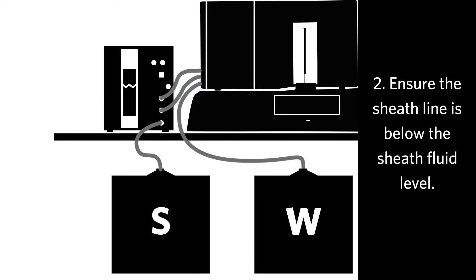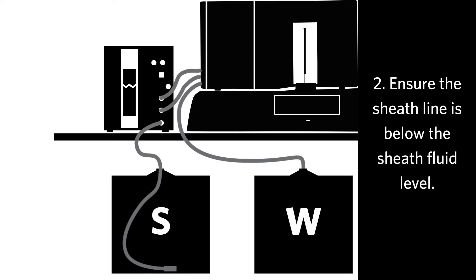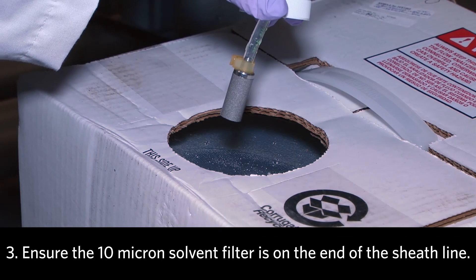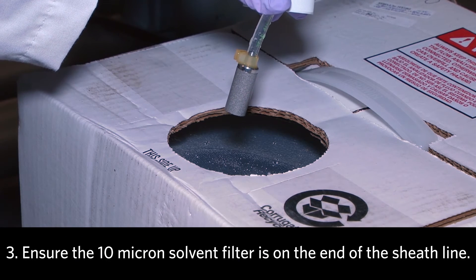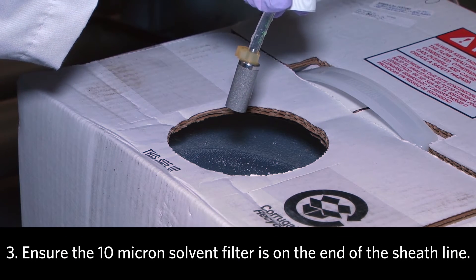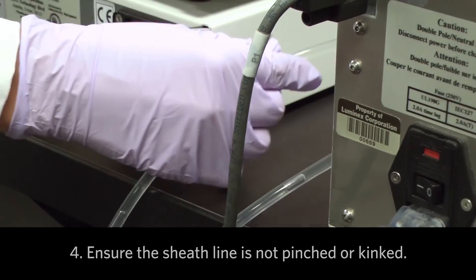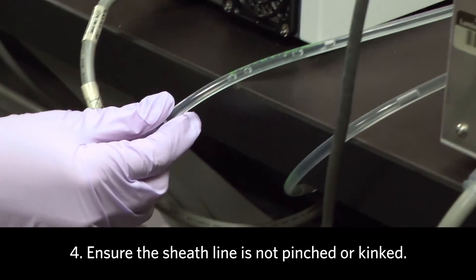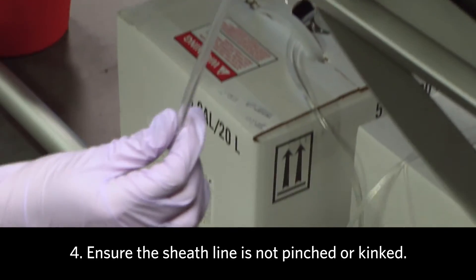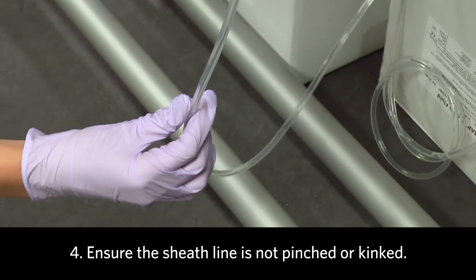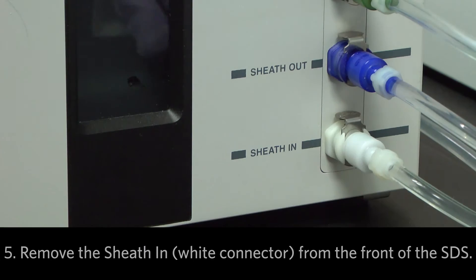If the line isn't in the liquid, push the line down until it is below the fluid level. Ensure the 10-micron solvent filter is on the end of the sheath line. Then follow the sheath line from the container to the SDS to ensure that it is not pinched or kinked.